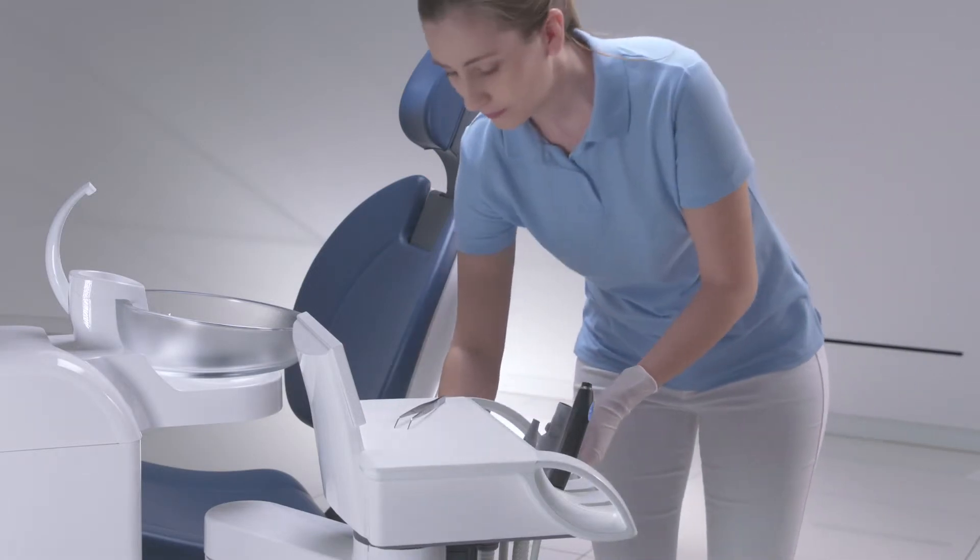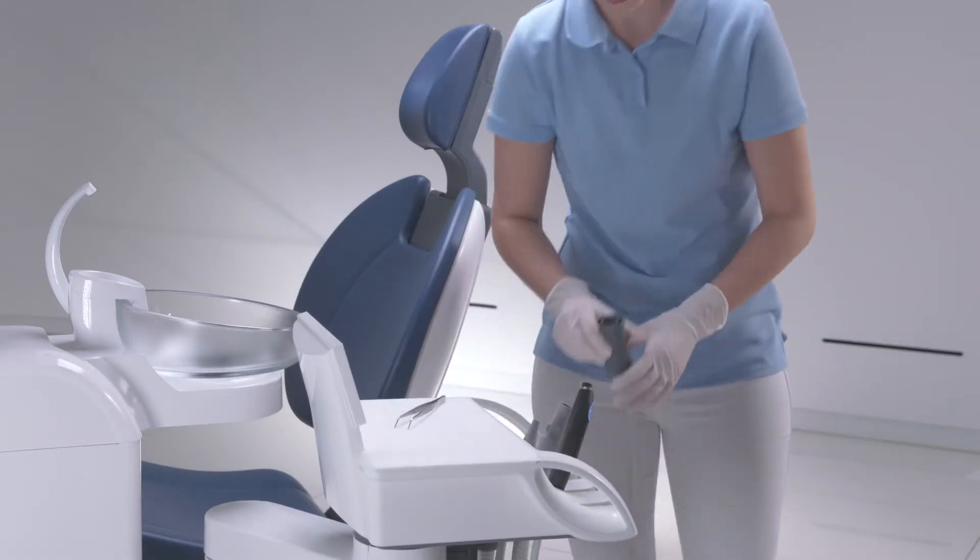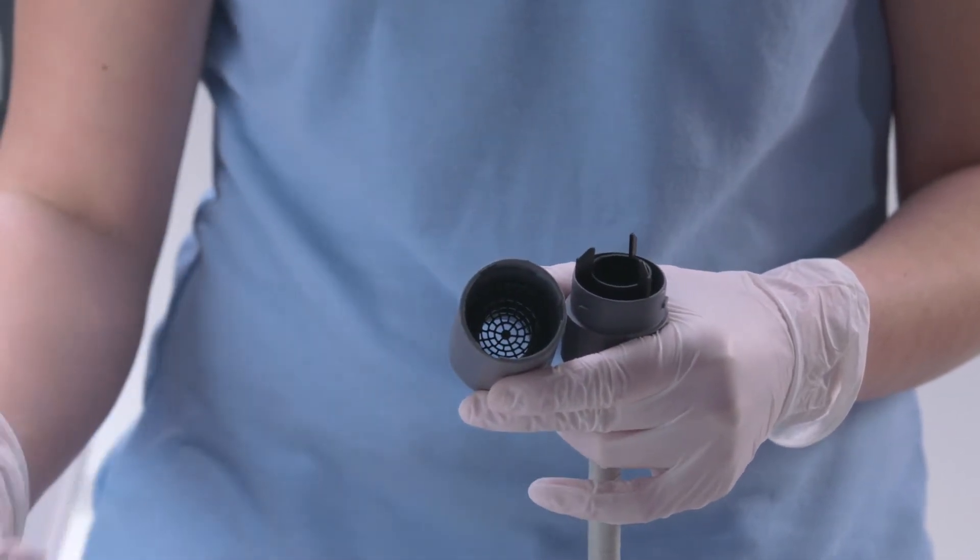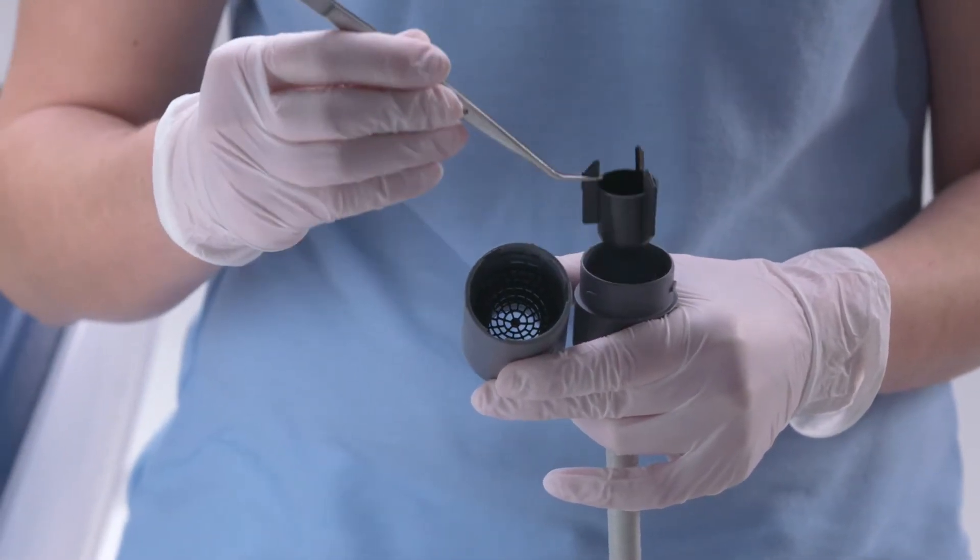Pull the filter housing from the connections on the assistant element and then disconnect the suction hoses from the filter housing. Take the collectors out of the suction hoses.